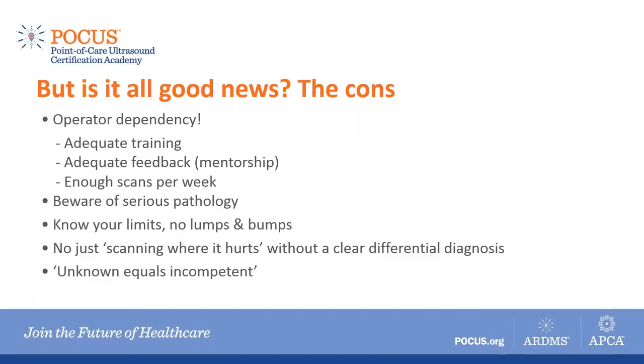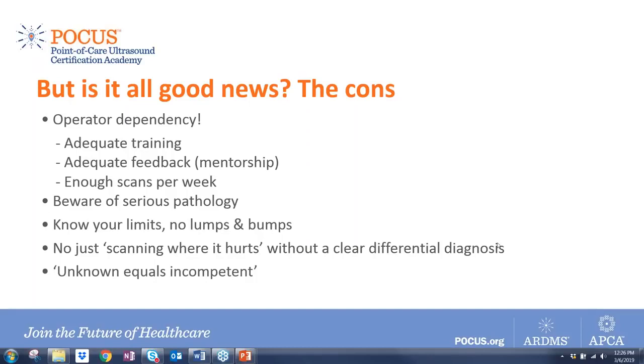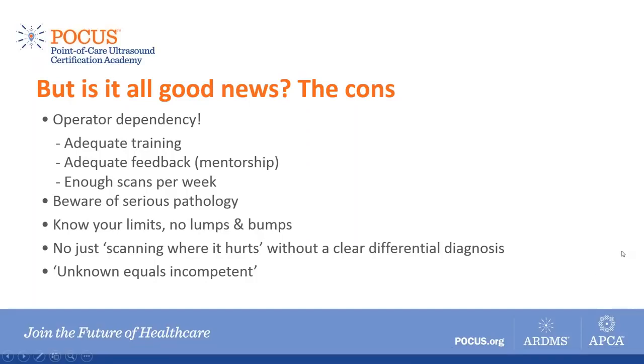First off, and by far the most important factor, is the fact that MSK ultrasound is difficult and it's operator dependent. To become a good sonographer, you need lots of experience and you have to put a lot of time and money into training. There is a common pitfall, and that is that people tend to invest in an ultrasound machine, but not in adequate training. And this can have some serious consequences for the quality of care, because the quality of the machine will not make up for the low quality of the sonographer.